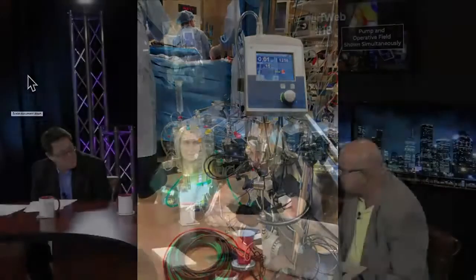How long did it take you to set that up, Patrick? In the OR? Yeah. Roger came in and did the feed from the vitals first the night before, to make sure that all works. It's about an hour to test everything and all that.